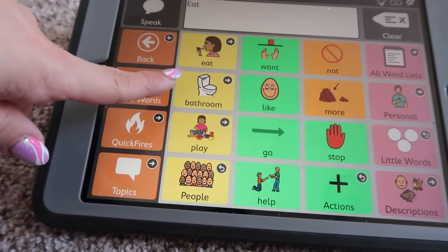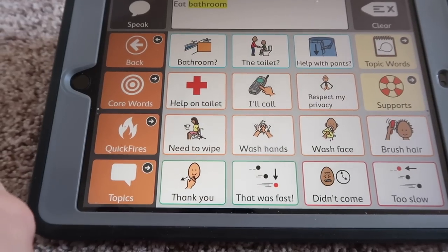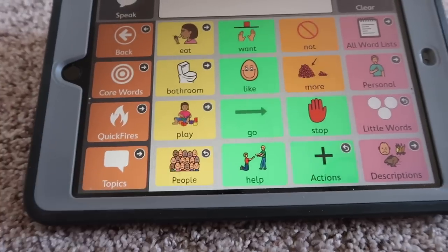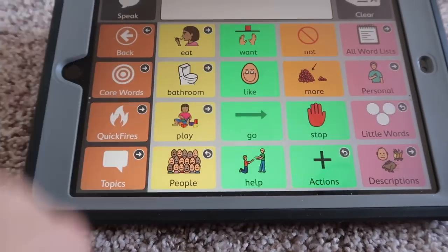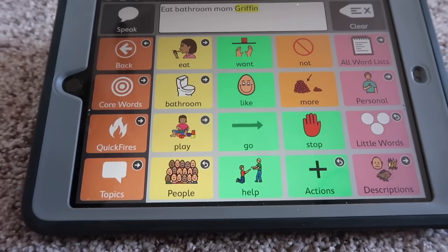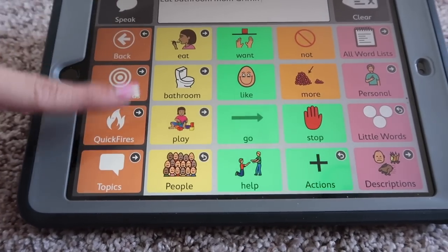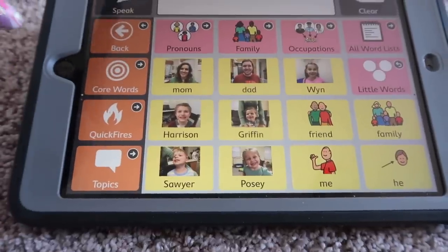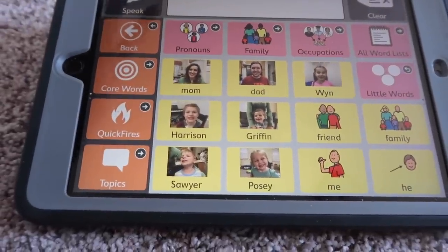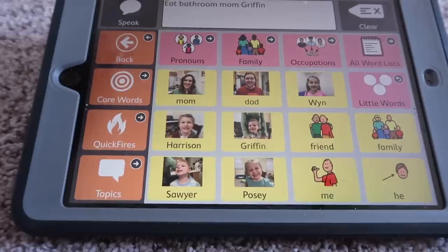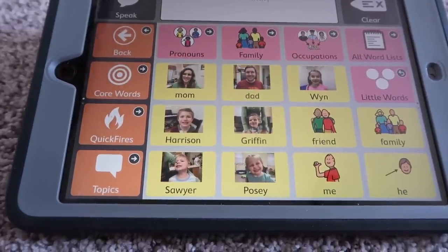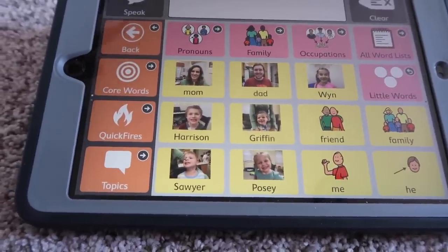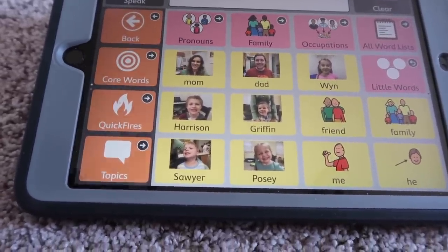We have bathroom because we are working on potty training right now. We have people, which includes our family — mom, Griffin — and we put our own personalized pictures. We are going to be adding all about Lindy and her things about herself, what she likes to do, so she can ask people questions, which is very, very cool. Griffin has that a little bit, but we're going to go into even more detail with her because she can actually play games and do more than Griffin can.